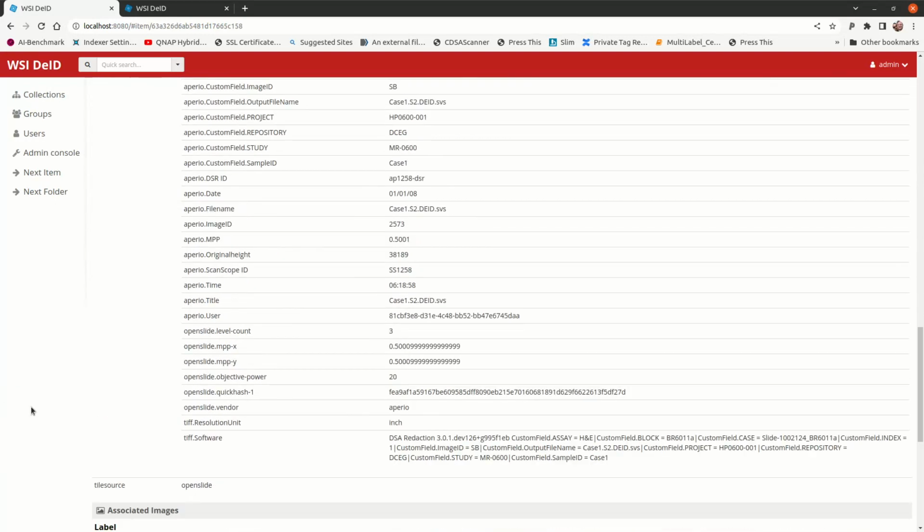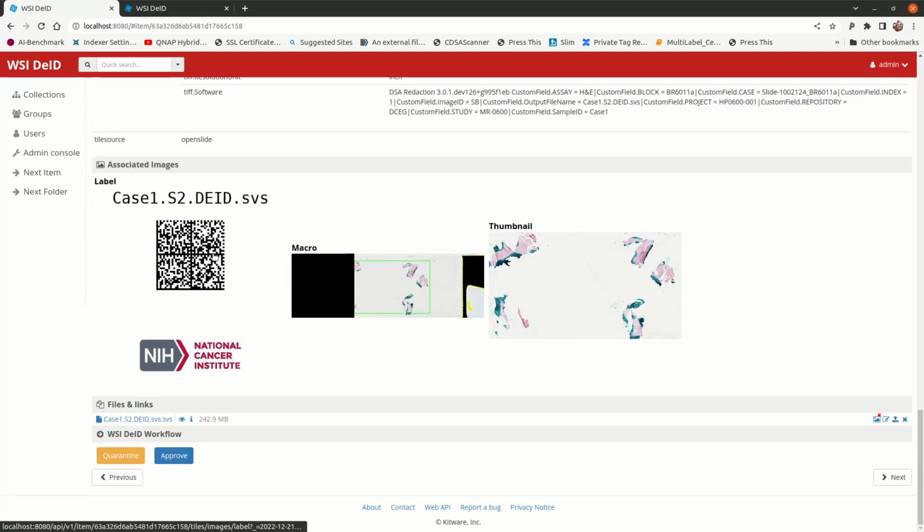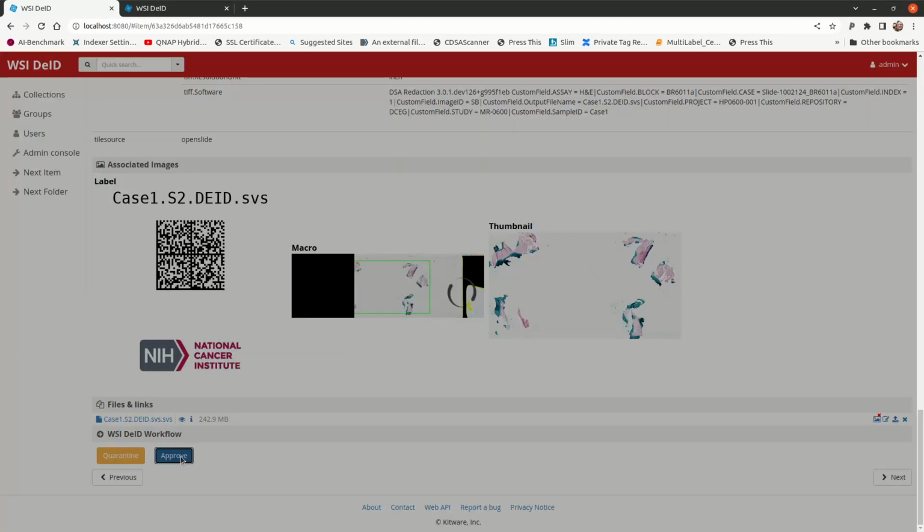There's all of this stuff, which is provided by Scott, that CSV file. It encodes most, if not all, of this into the data matrix label that we've generated. And this can be changed depending. So once we've done that, we can hit approve.